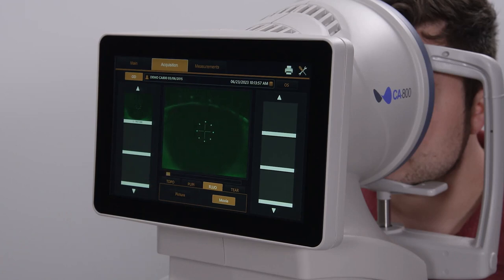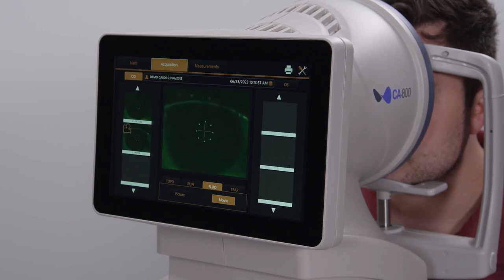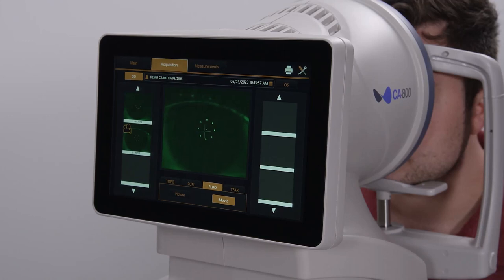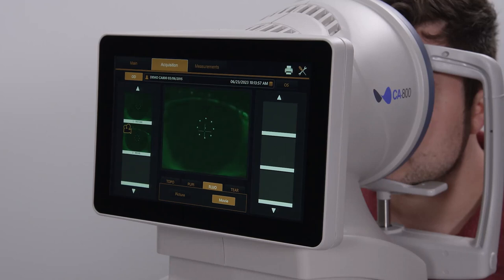If capturing a video, push the joystick button a second time to stop the video. Otherwise, the video capture will stop on its own after about 16 seconds. And that is all that is needed to acquire fluorescein images or movie footage of the eye using the CA800. For more information, please go to TopConHealthcare.com.